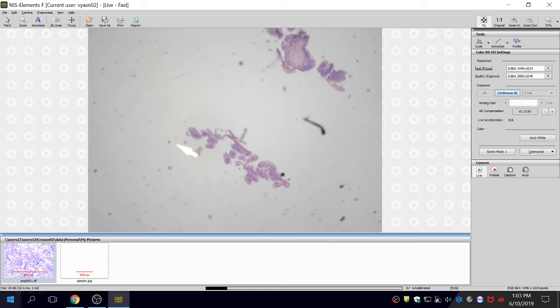Generally, the classification is flat lesion and papillary lesion, right? Flat lesions include reactive atypia, usually with inflammation or some other cause. Then you go to urothelial dysplasia, that means low grade dysplasia, falling short of CIS. I'm talking about the flat lesions. Then we go to carcinoma in situ, a flat lesion. For invasive, you may have a flat lesion. In the papillary group, you have papilloma, PUNLMP, low grade, high grade, non-invasive, invasive, right?